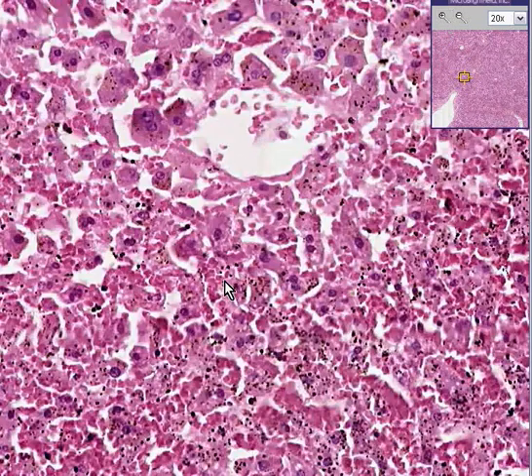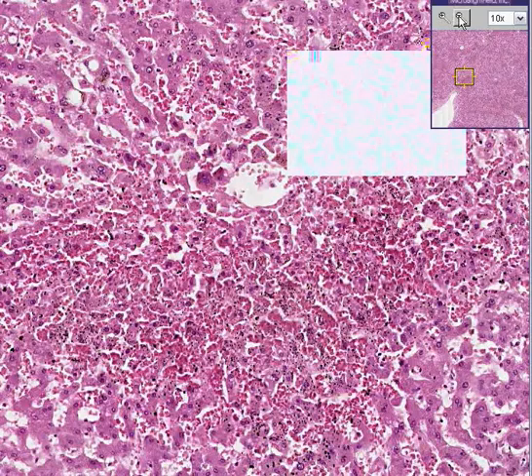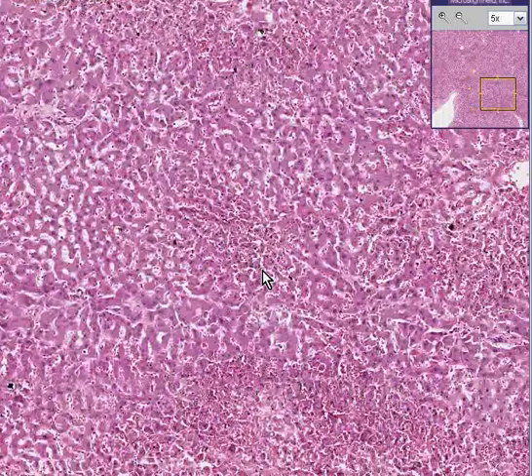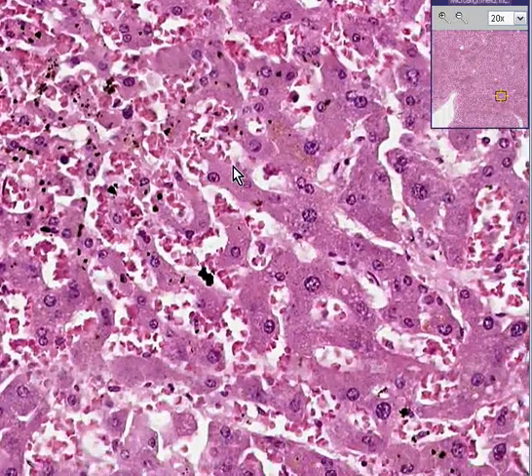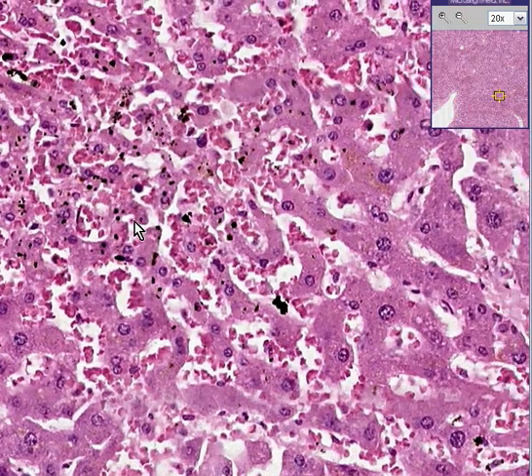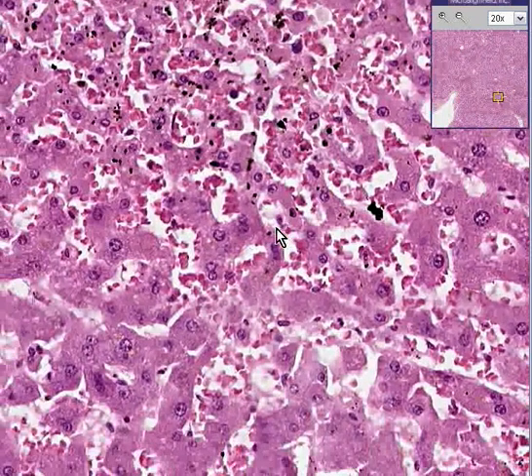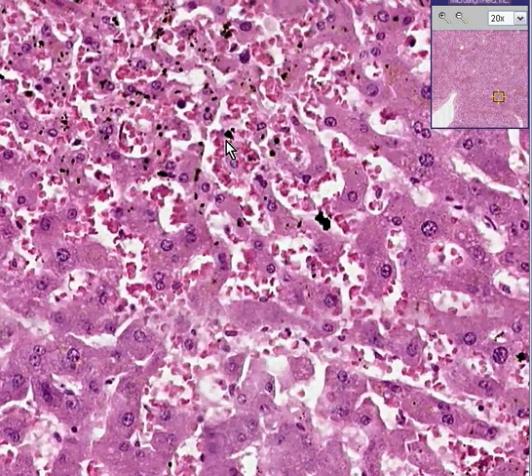Note that the longer or more chronic the degree of congestion or stasis, the more likely you are to pick up hemosiderin cells within this area. So when you are looking in this area and you see hemosiderin cells, you can assume it was chronically congested. But don't be fooled — this little brownish pigment here represents probably bile within hepatocytes. Out here in the sinusoids and central vein area there is really not very much pigment at all; these are just fresh red cells.